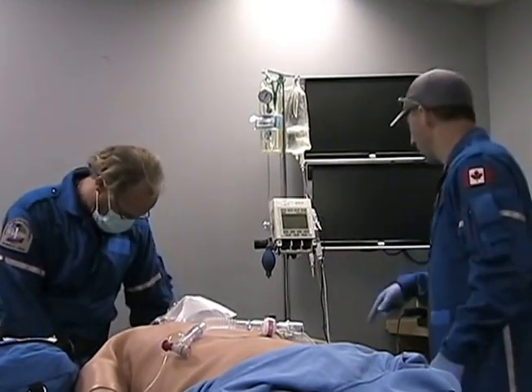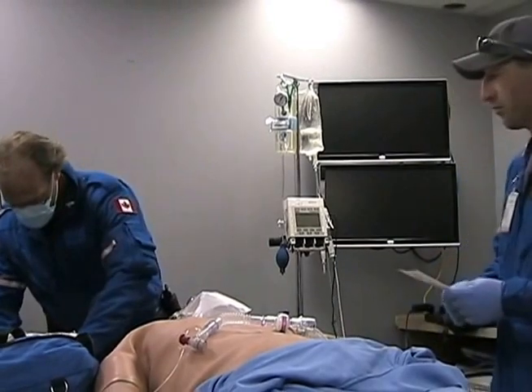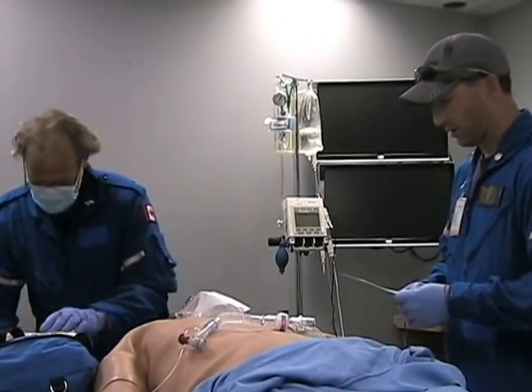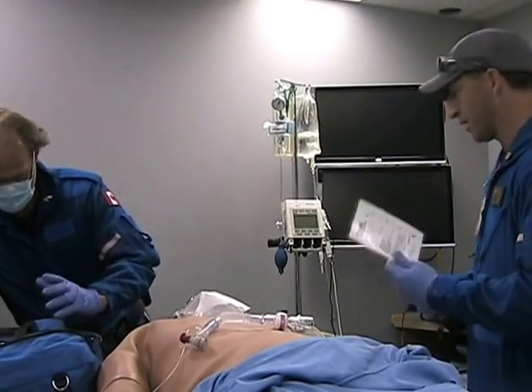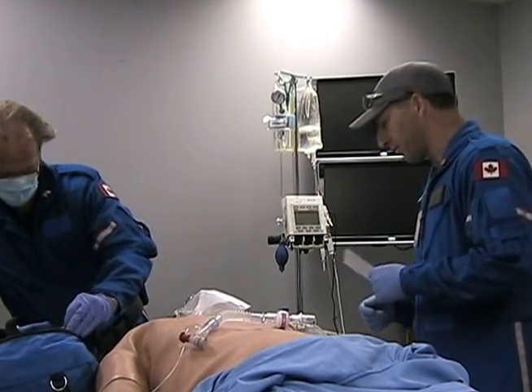And my line's running well. I'll get you that checklist. Oh, super. Yeah, these checklists are great, hey? Yeah, it sure helps a lot. You know, it'd be great if we had another person to read this off, but since there's just the 2 of us, we'll get through this, no problem.